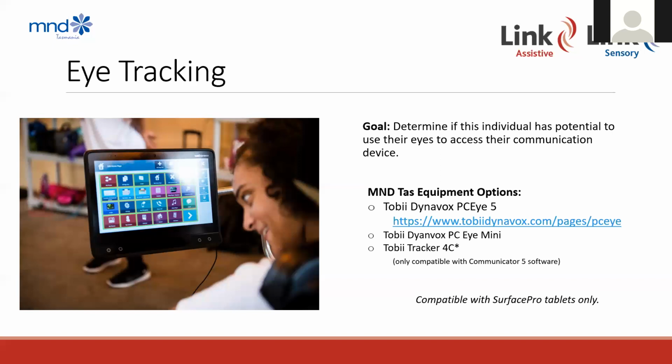So that's the detail about the equipment options that are available. But just to give a little more information about eye tracking technology in general for those people who are not familiar with it. Basically, eye gaze technology works by sending out an infrared signal that bounces off your retina and tracks where your eyes are looking on the screen.